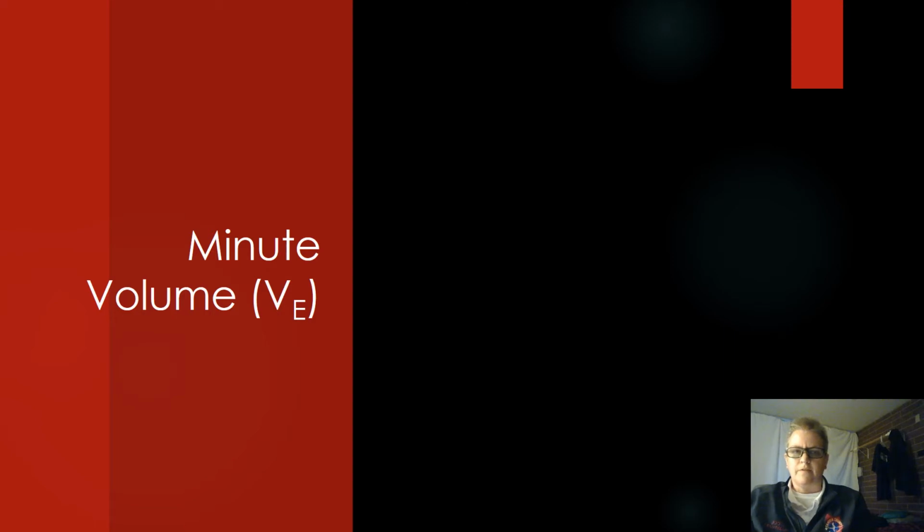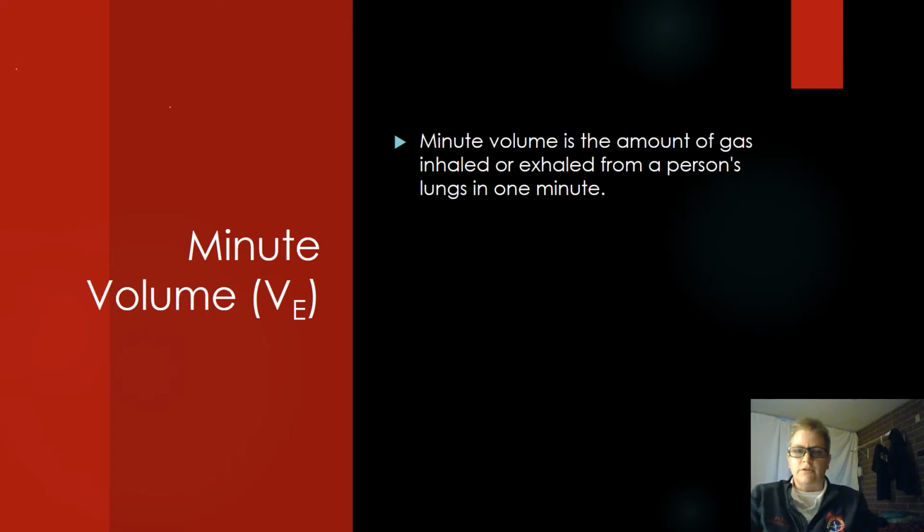Okay, minute volume, a very, very important concept when talking about and understanding ventilators. So what is minute volume? You know the definition. Minute volume is the amount of gas inhaled or exhaled from a person's lungs in 1 minute. So we have minute volume. We also have alveolar ventilation, which is pretty important. What is actually getting to our alveoli? And that's a very important concept to understand as well.